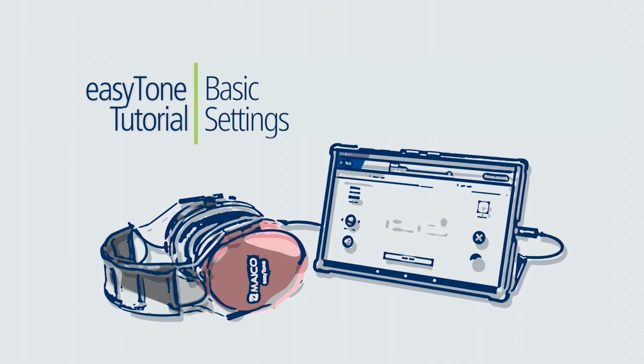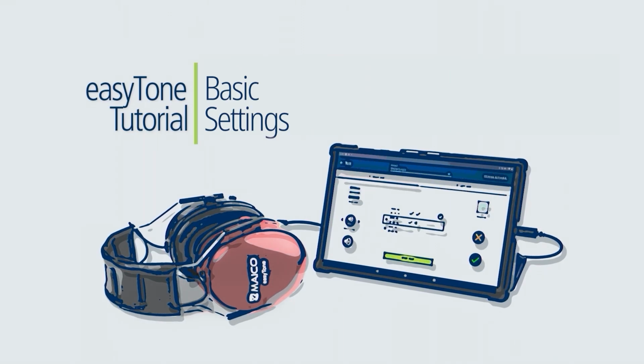This completes the tutorial on basic settings. Please continue through the tutorial series for additional easyTone instruction.